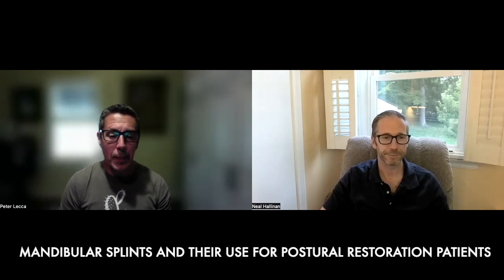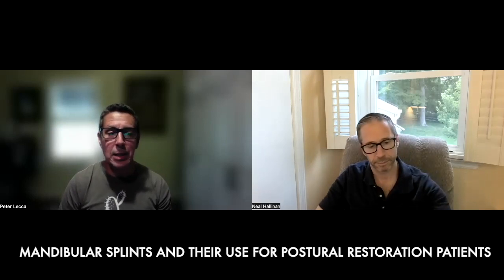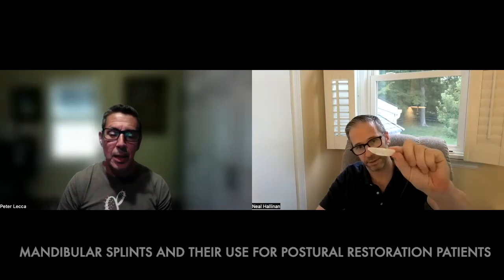One is a flat plane appliance that covers all the teeth, like this, that builds in an anterior guidance into the system. Can you just describe anterior guidance?